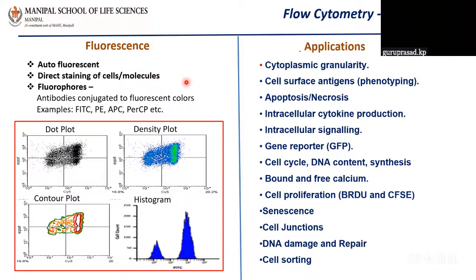For example, recall our earlier session where I talked about identification of blood group. We take anti-sera A, anti-sera B and anti-D, which contain antibody A, antibody B and antibody for positive or negative of the blood group.